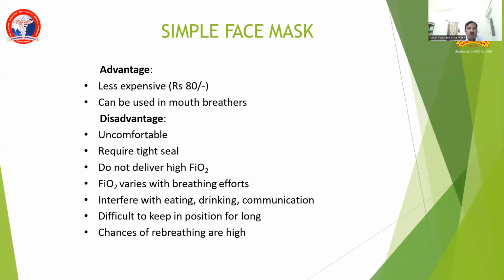Advantages of a simple face mask include less expensive, can be used in mouth breathers. Disadvantages: uncomfortable, requires a tight seal, does not deliver high FiO2, that is inspired oxygen concentration. Inspired oxygen concentration varies with the breathing efforts, interferes with eating, drinking, and communication, difficult to keep in position for a long time, chances of rebreathing are very high.